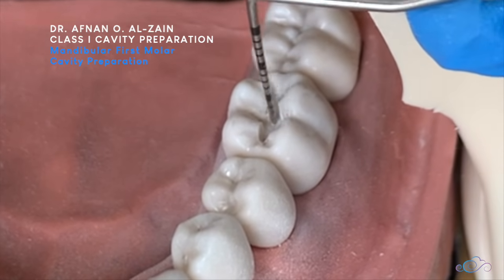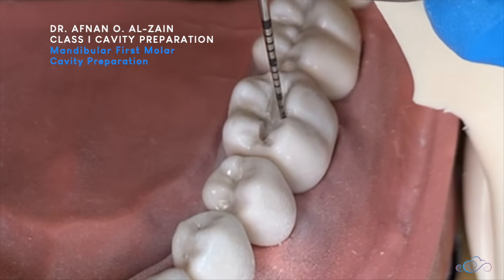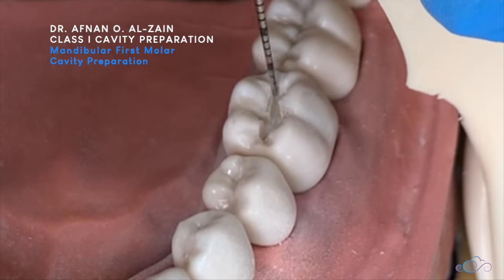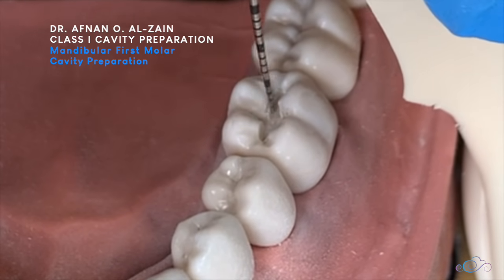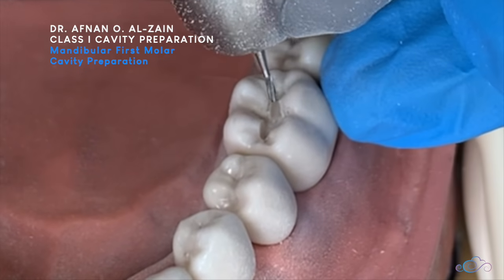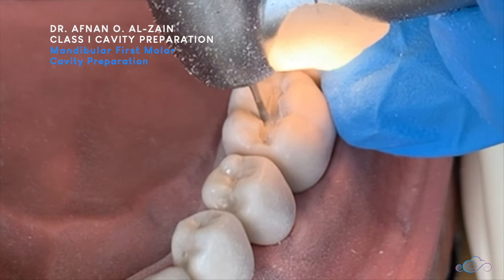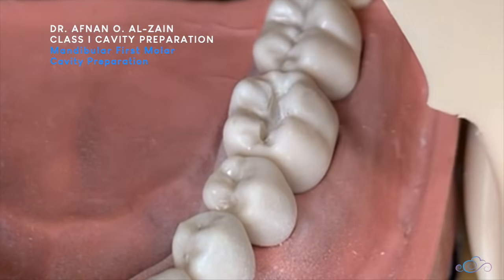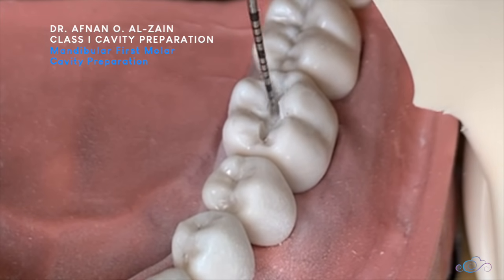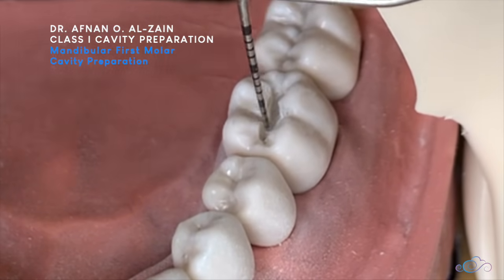We're checking one last time — we don't have any problem catching. Now we complete the cavity.